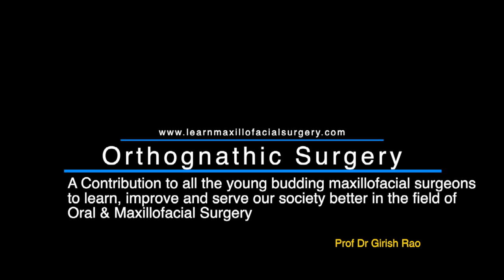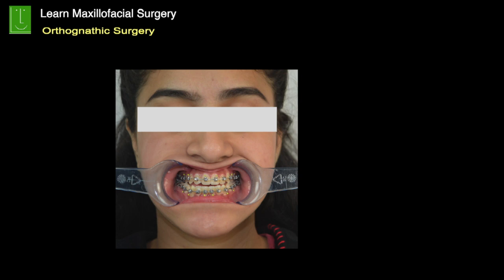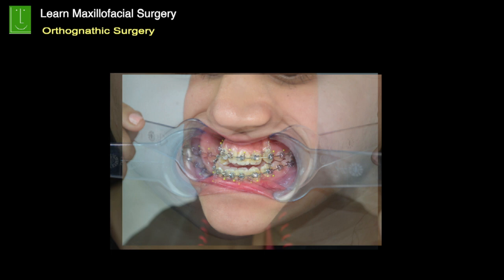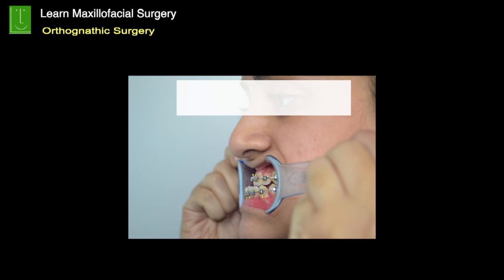Today we are going to show you a video on orthognathic surgery and mandibular setback osteotomy, bilateral sagittal split osteotomy. This is a young patient who has a prognathic mandible with a class 3 relationship. She's got a reverse overjet of about 6 millimeters, and we have planned for a mandibular setback of about 8 millimeters.